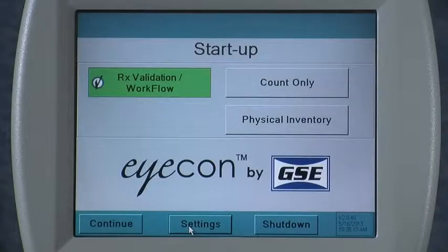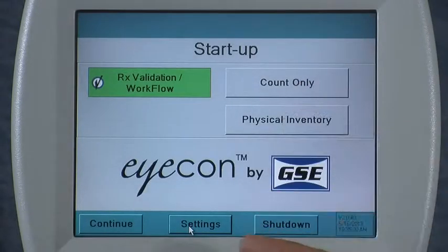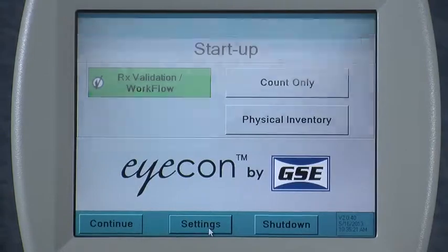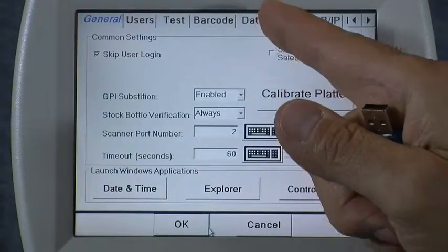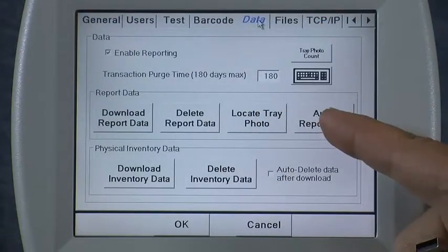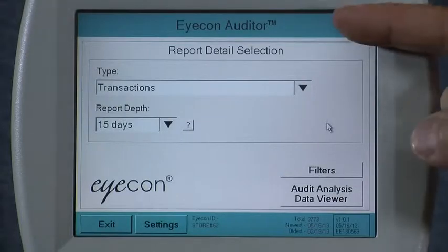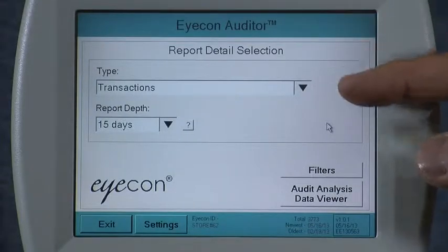Let's take a look at the audit report functions included on the ICON. From the main startup menu, press the Settings button and select the Data tab. Then press the Audit Report Data button. This brings up the ICON Auditor main menu.